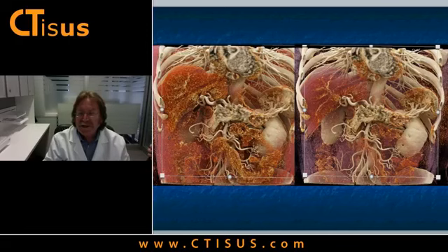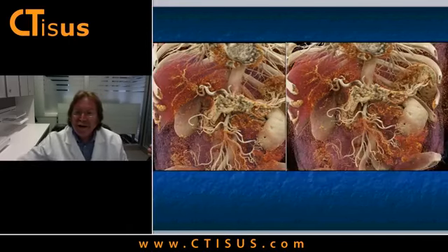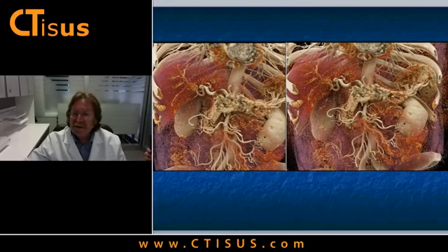You also get a good look at the patient's celiac and SMA. And then I'll just move that along a little bit and now show you another view, again, accentuating the difference in attenuation and appearance between the normal pancreas and the patient's tumor. And Linda Chu has written a very nice article about this. Hopefully it will be accepted in AJR soon. Again, a good look at the vessels and the kidney.